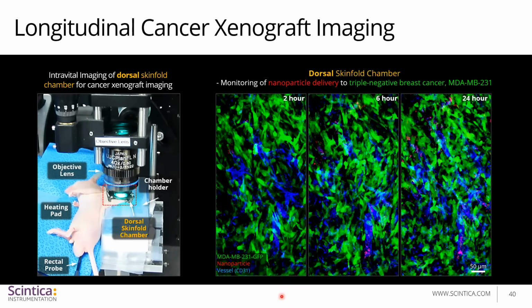So here is evaluated how the nanoparticles, after injection into the bloodstream, reach the tumor and extravasate from the blood vessel to infiltrate the tumor site and start treatment. Multiple time points are collected, but here within the first 24 hours after injection.